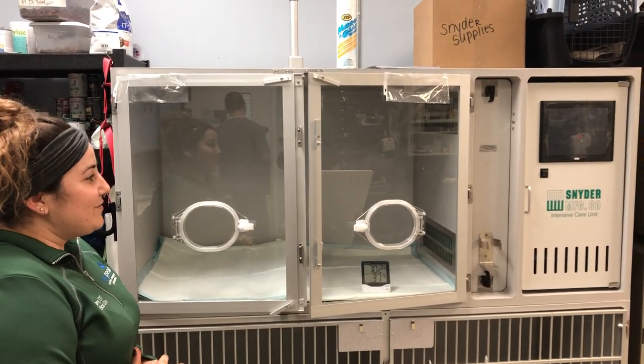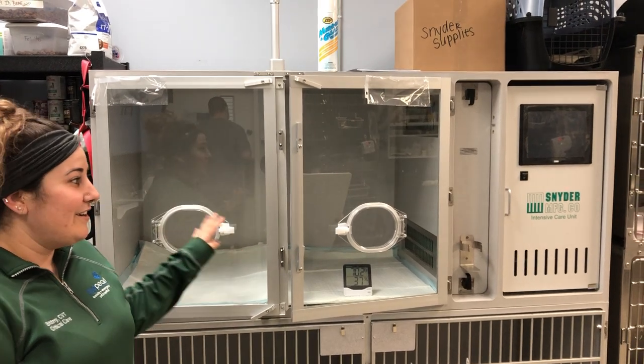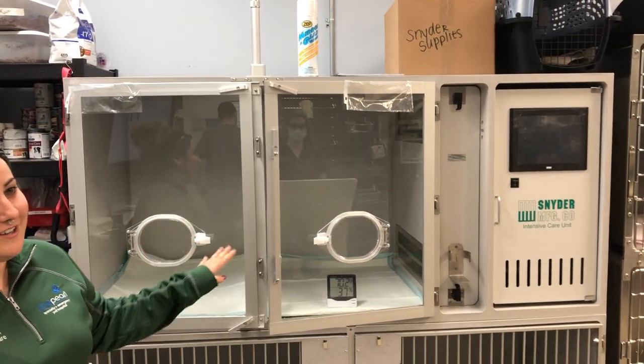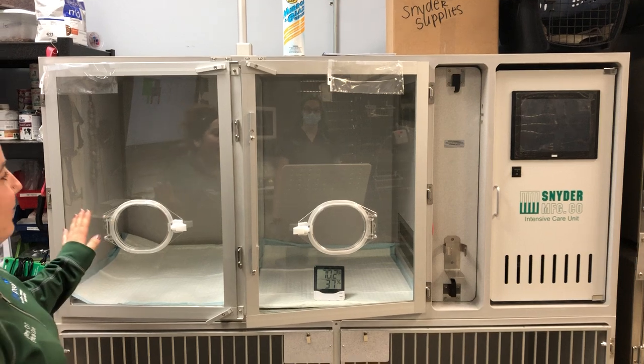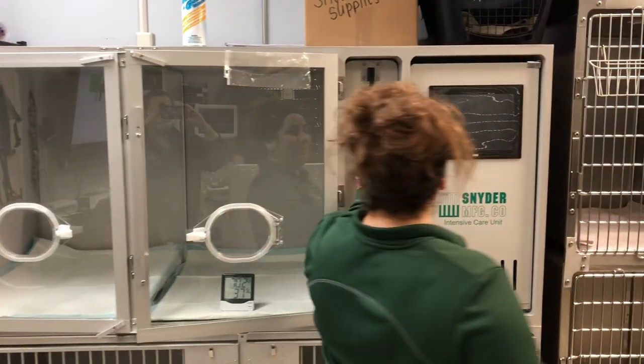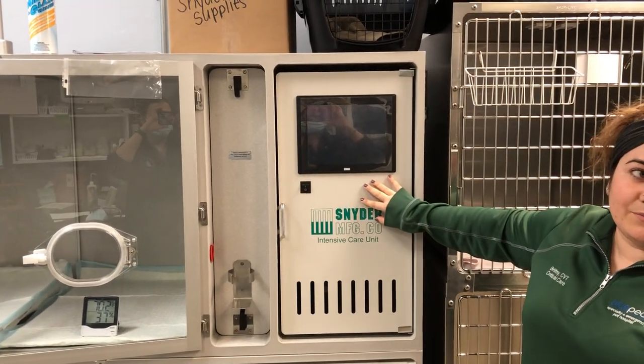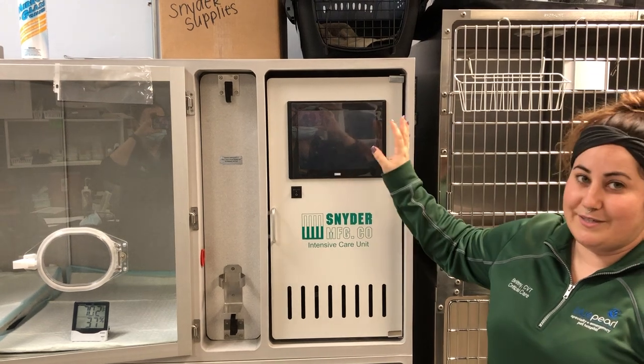Today we're going to show you how to set up and get a patient ready to go into the Snyder Model 2100 oxygen unit. You have compartment A where the patient goes, compartment B which is where the soda lime tray and the coils live, and compartment C which is where the operating unit is.